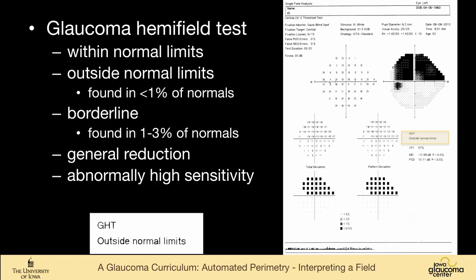The options for hemifield tests are within normal limits, outside normal limits, like in our patient, meaning that this would occur in less than 1% of normals, borderline would occur in 1 to 3% of normals, general reduction in sensitivity, or abnormally high sensitivity are the choices.